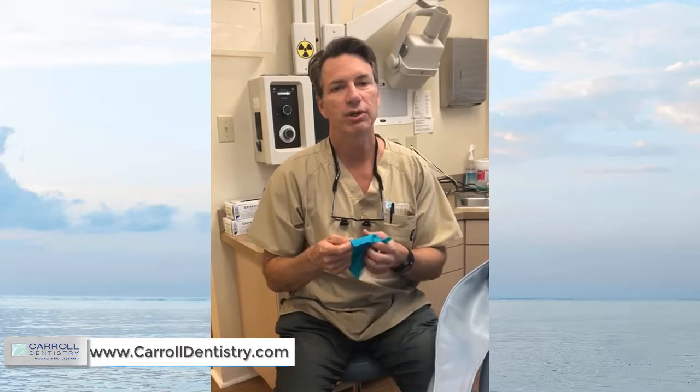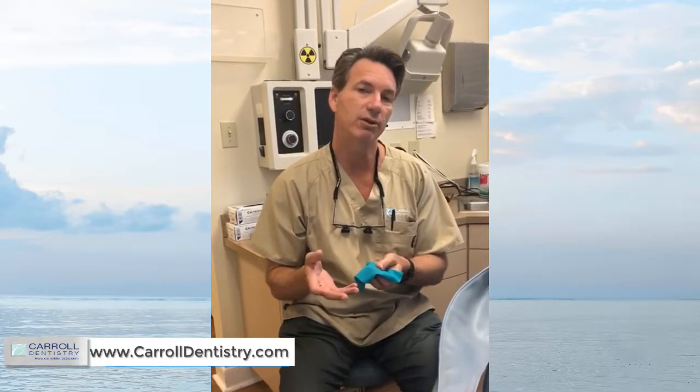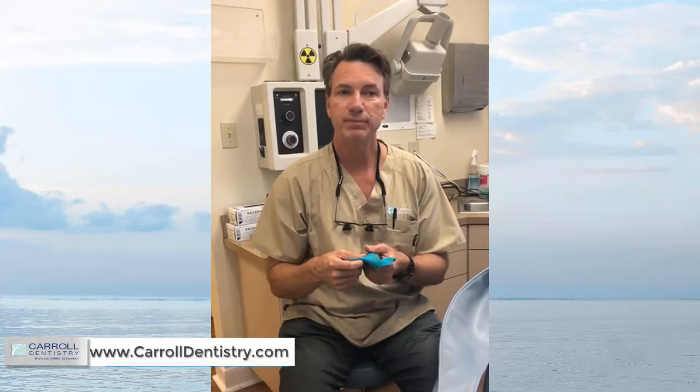When you're working with the BioClear system on procedures like black triangle closure or midline diastema closure, you are not going to use wedges. If you're not wedging the matrices to hold them in place, the rubber dam works like a turtleneck sweater around the tooth — you punch a relatively small hole so it fits tight at the neck of the tooth, and then you're tucking the matrices into that turtleneck sweater.